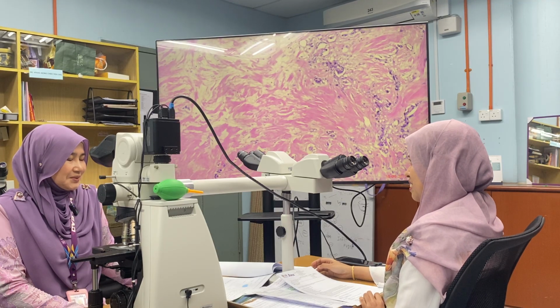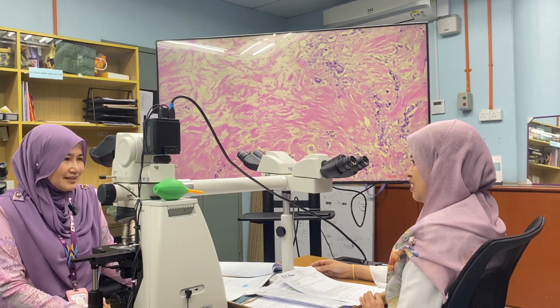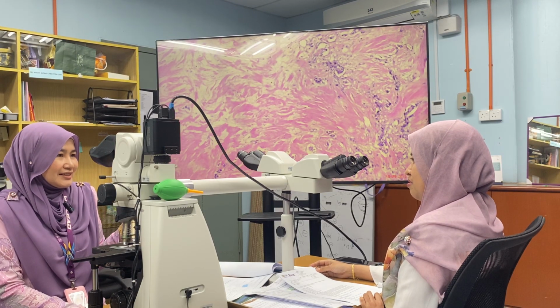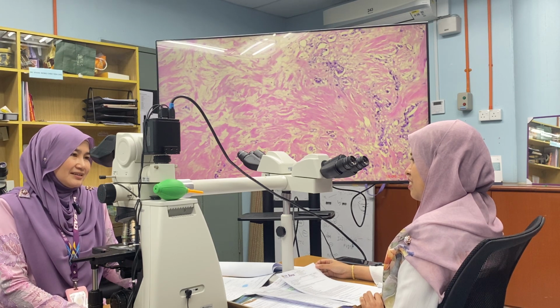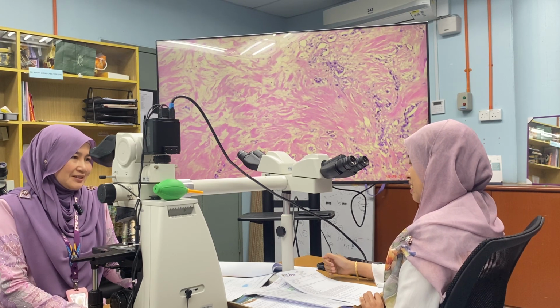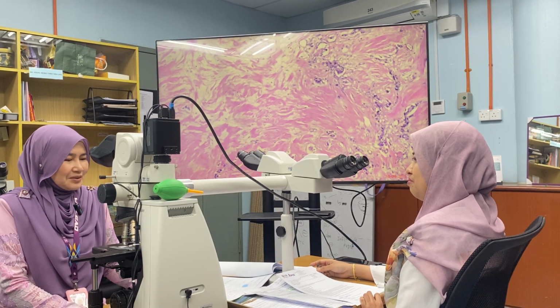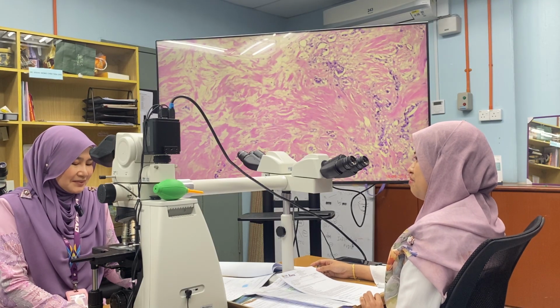So no membranous expression at all. Yes. Even a little expression which is less than 10%, you need to consider it. Maybe if there's a little, we can score it as 0 plus or something. Or 1 plus, maybe if it is more than 10%. Yes. Is it? All right.